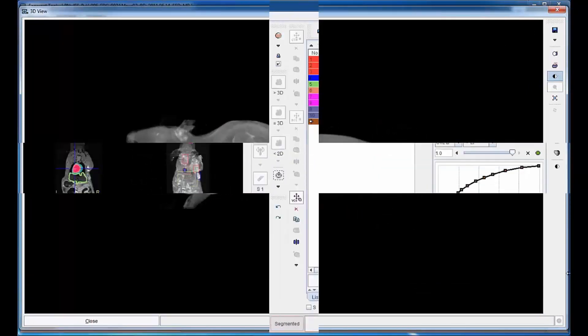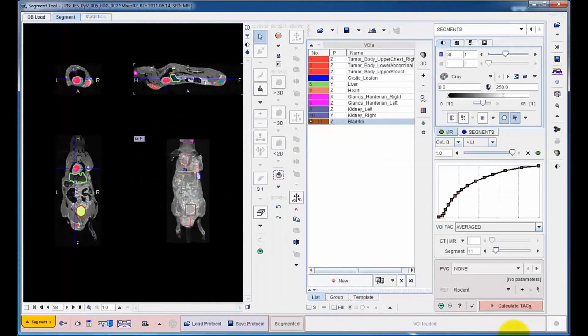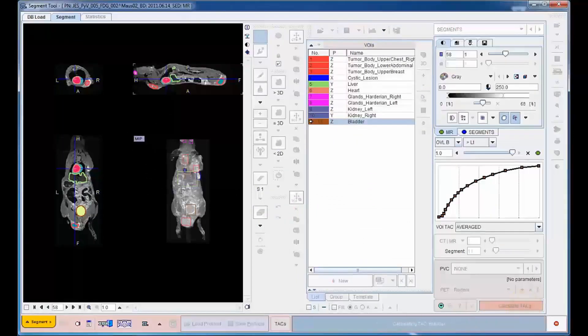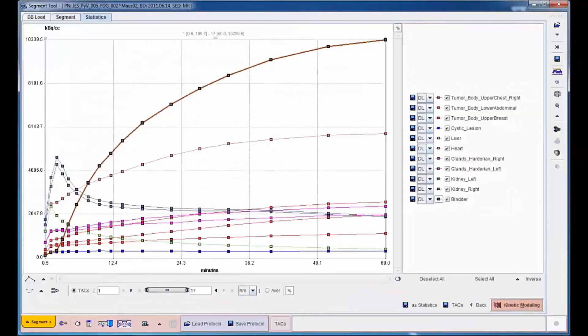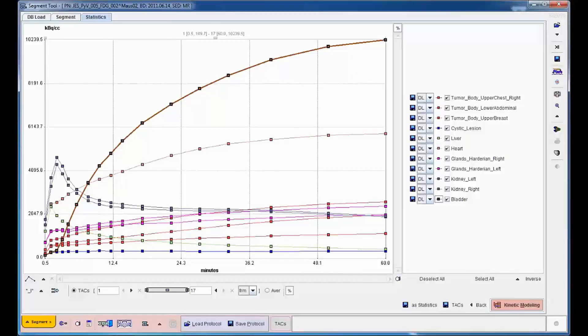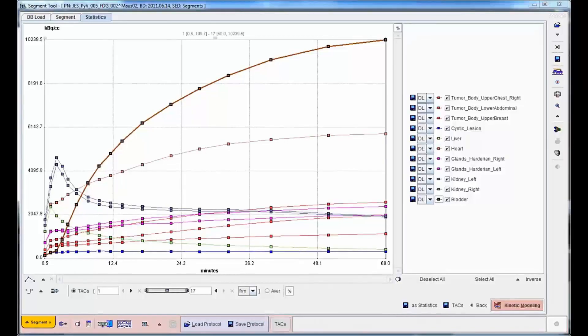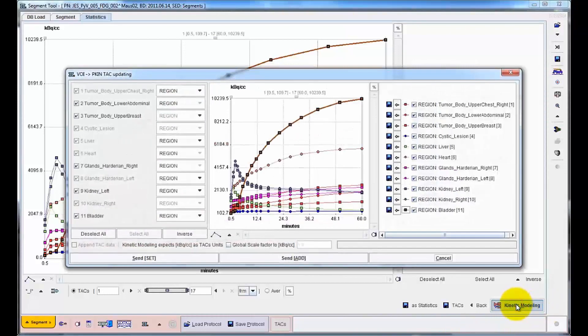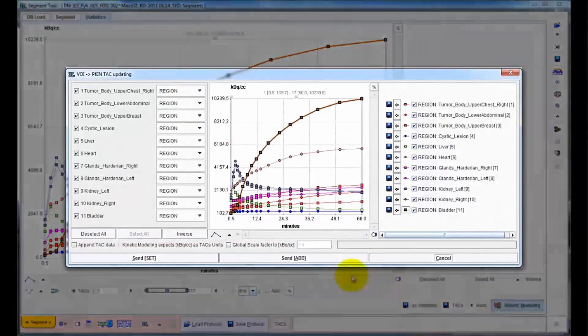Finally, the VOIs are applied to the dynamic PET series for calculating the average uptake curves. They form the basis for the actual quantitative assessment of tracer uptake in the tumor model and can be directly forwarded to the appropriate pharmacokinetic tool in PMOD.